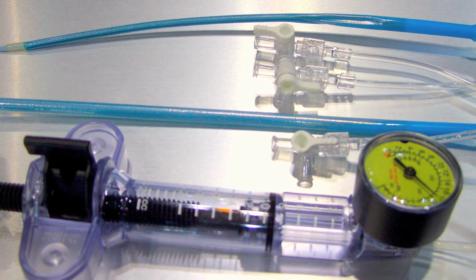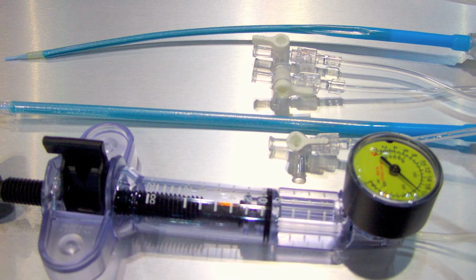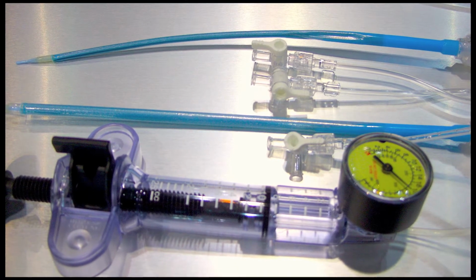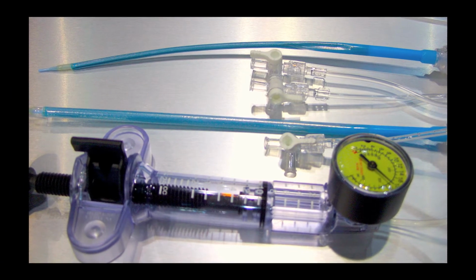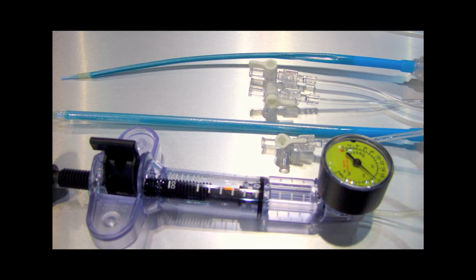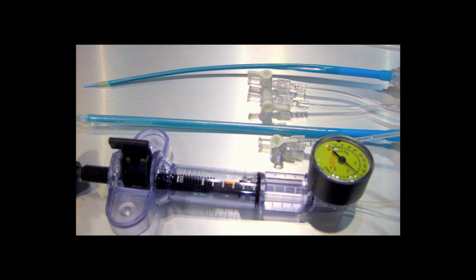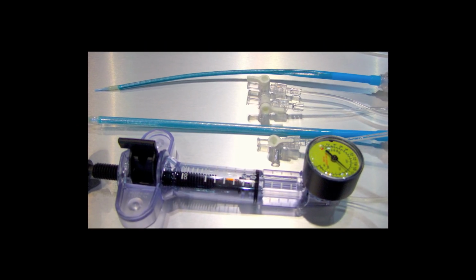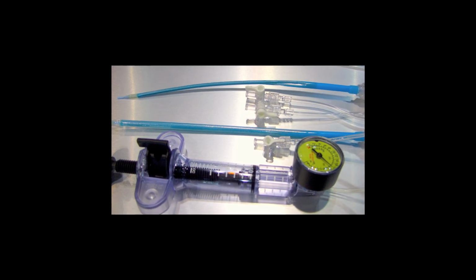The SoloPath introducer is stepped to enter the femoral artery as a 5.5 French device and then steps up to an outer diameter of 20.5 French. The device is inserted in a folded state and is expanded using a balloon inflation catheter. This allows for less vessel trauma when there is a need to introduce larger devices such as percutaneous valves or endovascular stent grafts. Once the procedure is over, the introducer sheath can actually be collapsed so it comes out with less trauma.